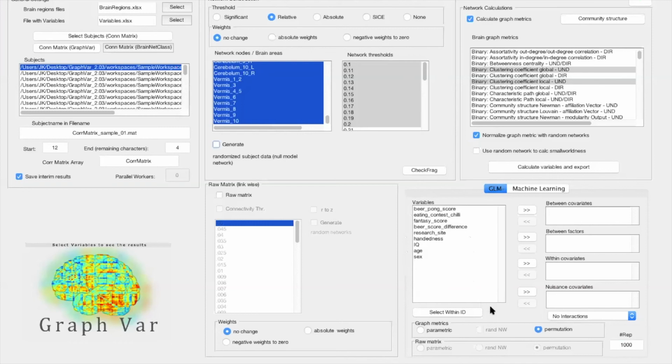So if you, for example, would use SPSS and you would do several correlation analyses, in the end you get one big table where each correlation analysis, for example, of age, IQ to, let's say, those exported values, is independent of each other. But this is not the case if we set up a GLM, because a GLM is a big formula and we try to explain our fMRI data.